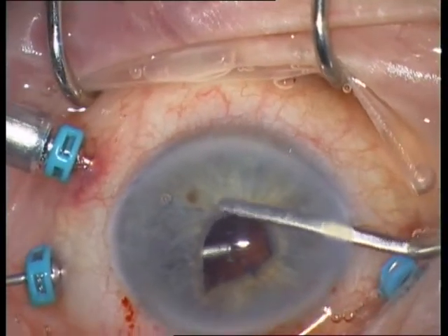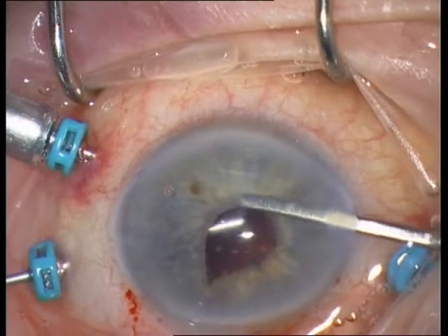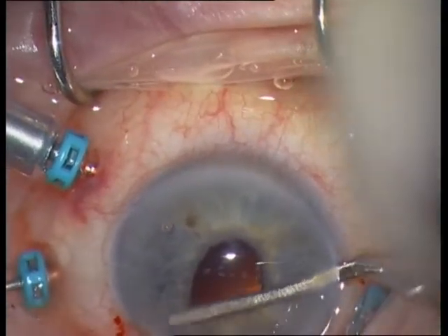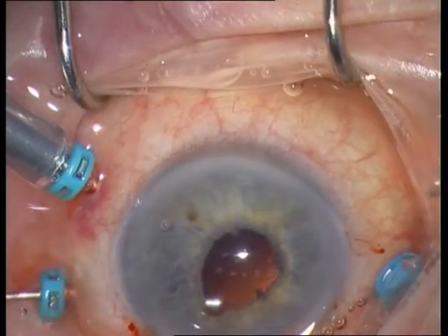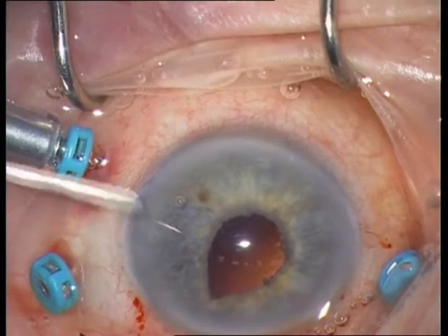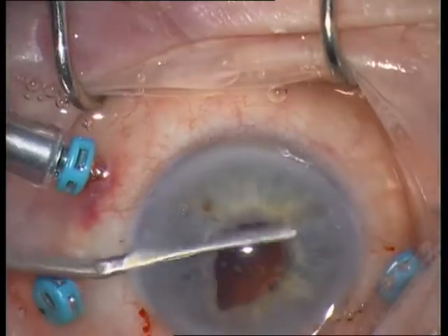Observe the ectopic pupil — if you see such a pupil, you must suspect a vitreous strand. But I cannot find a vitreous strand, and the pupil is still ectopic, which is a bit unusual. I am checking again from the temporal side, but I still cannot find a vitreous strand.